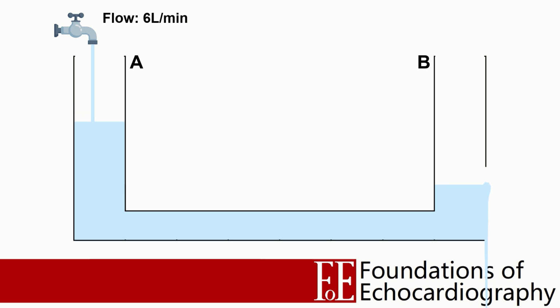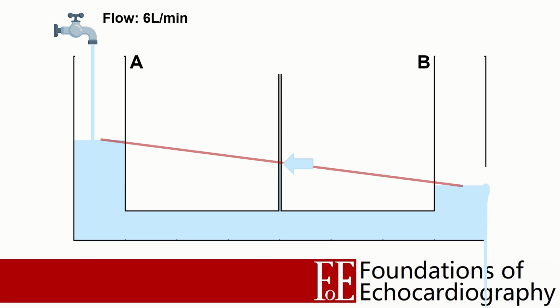If we reach steady state and then draw a line between our two tanks, we can see a visual representation of our pressure gradient. Interestingly, if we attach a manometer to our pipe anywhere along its length, we see that the pressure at that point is proportional to our distance along the pipe's length.